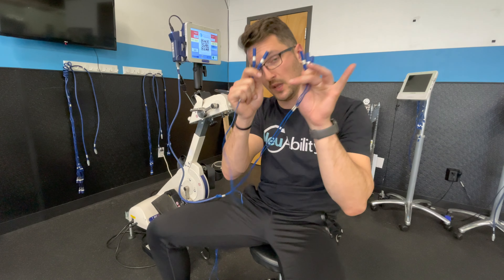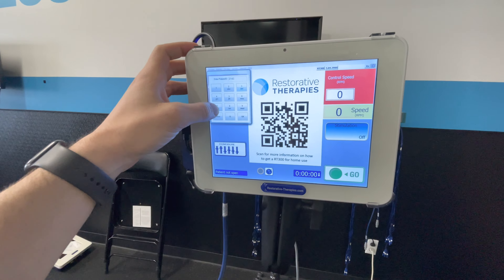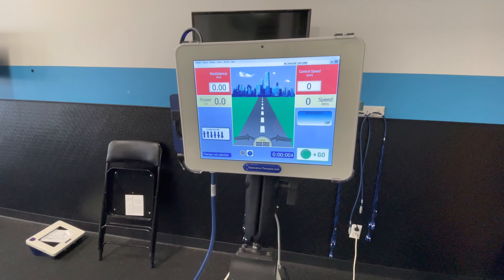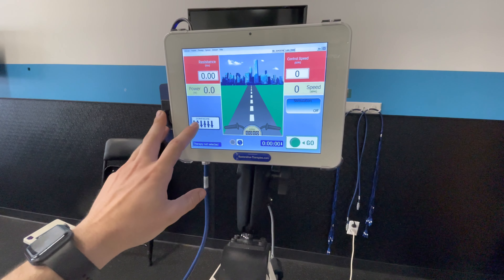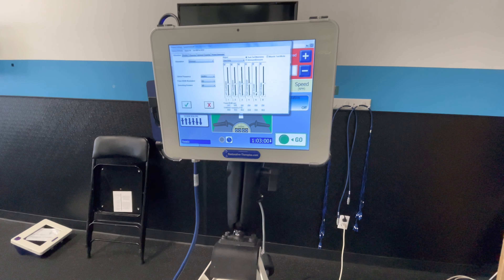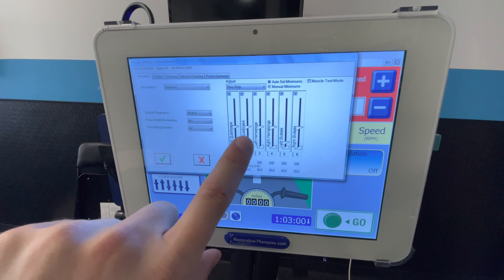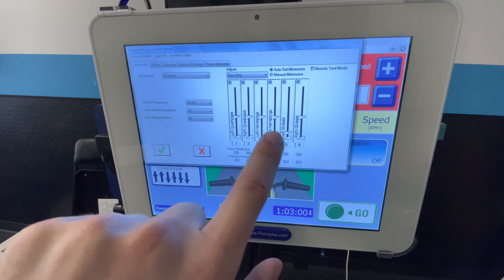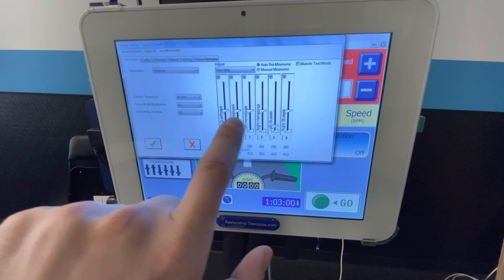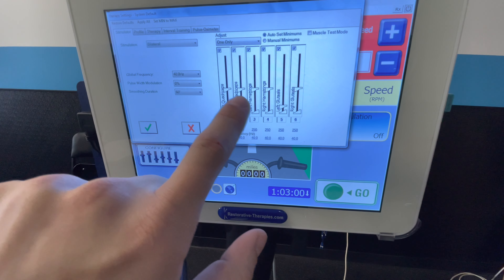We then align the corresponding muscle groups to the corresponding lines. Here I'm pulling up my therapy profile — I can click configure, go to system default, and you can see I have left and right quadriceps highlighted, right and left hamstrings highlighted, and glutes highlighted as well. The slide bars here indicate the level of intensity — the milliamps being used.